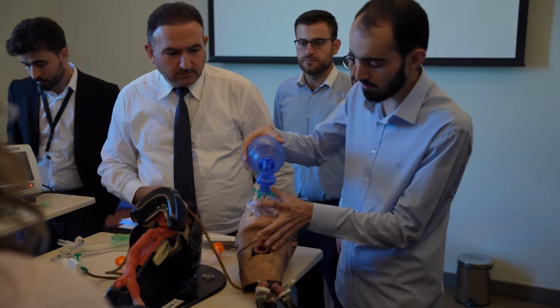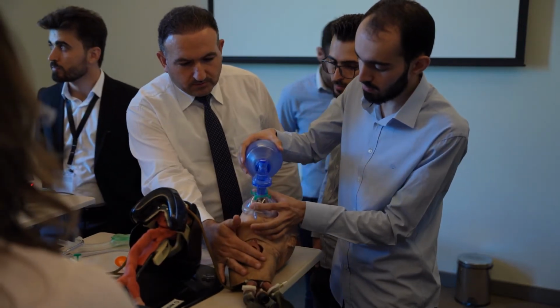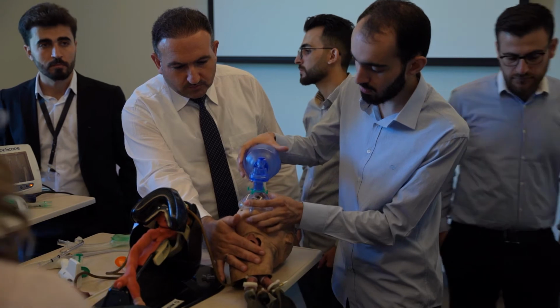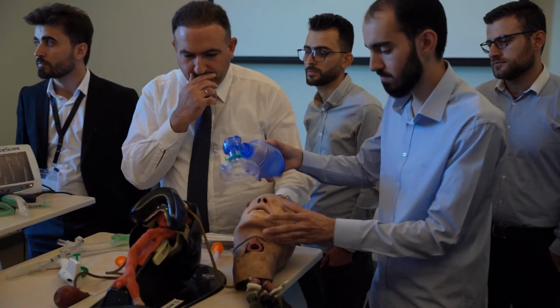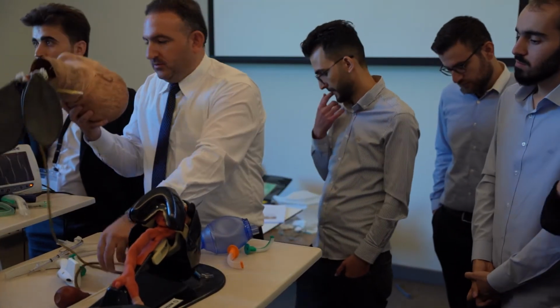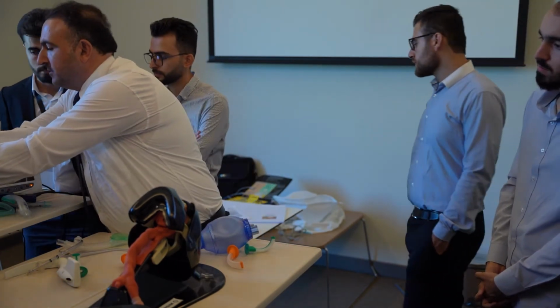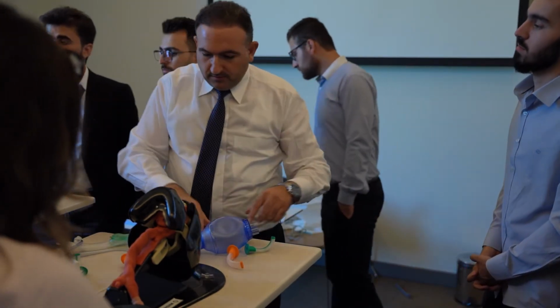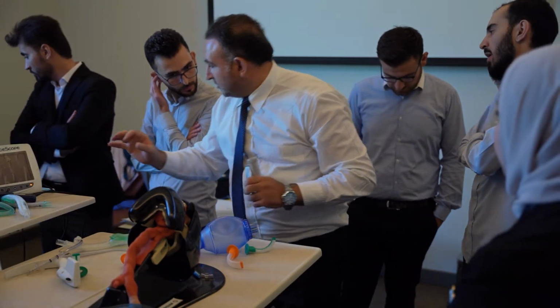For circulation, the usual classic way to access the vein is through a cannula. If you fail 2-3 times, the second alternative is more central veins, or intraosseous. It is intraosseous, okay? According to the guideline, even in the adult, if you cannot use intravenous access 3 times, you are going to use intraosseous.